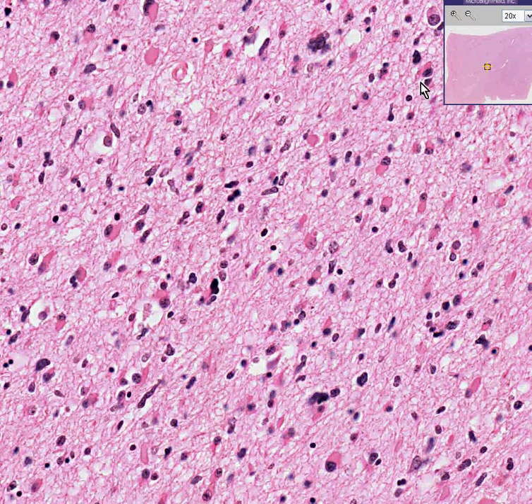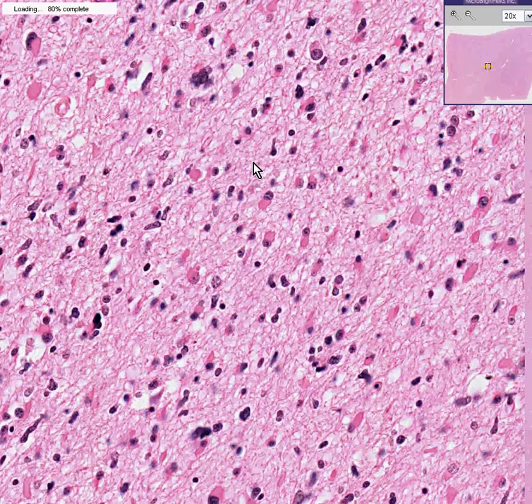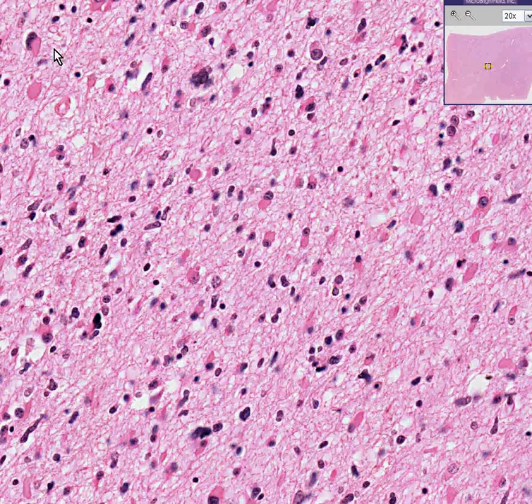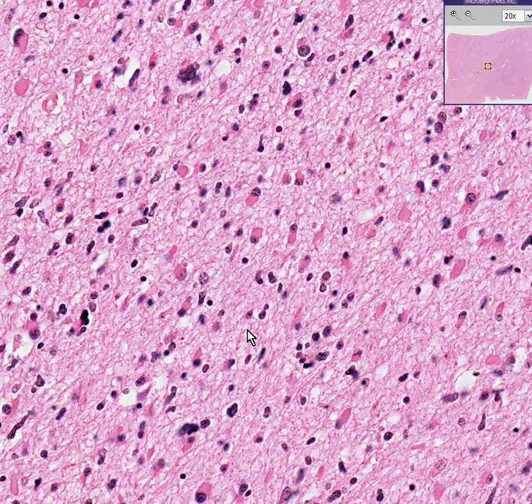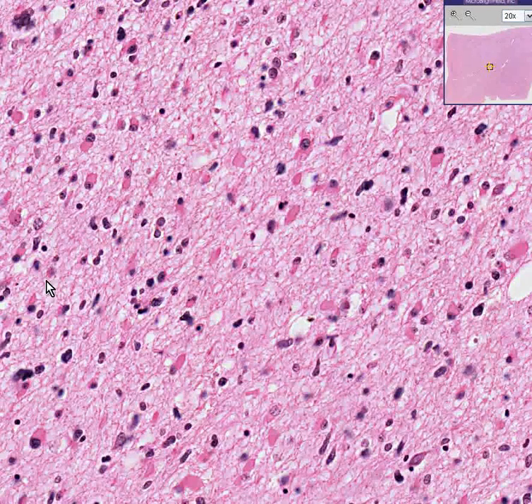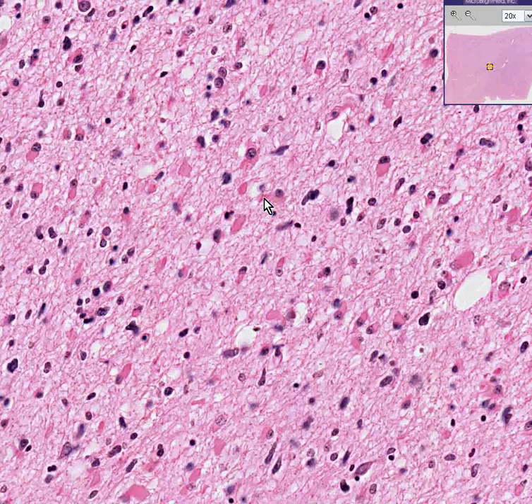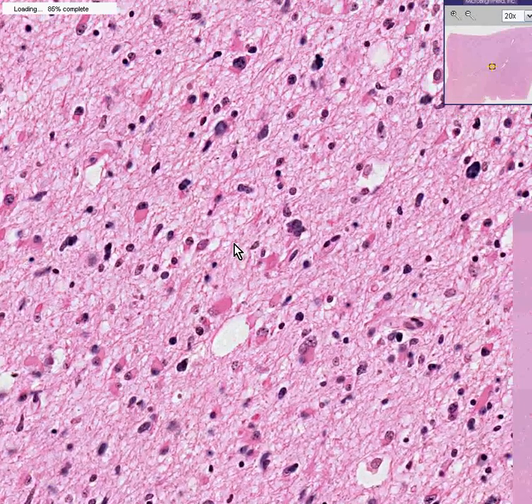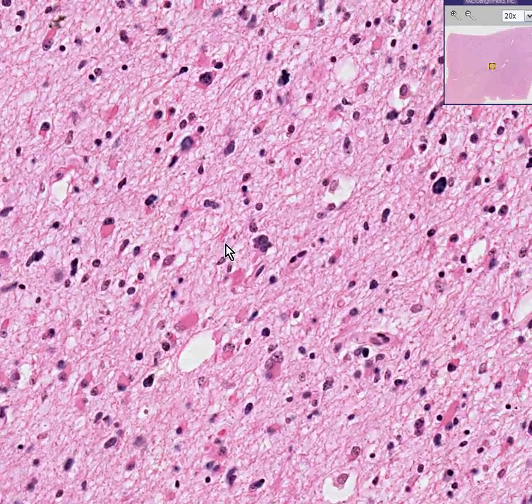Astrocytomas are generally called gliomas as well. Notice that they don't look terribly abnormal. Some may be a little bit bigger and darker than they should be, but for the most part, when you look at these cells — and 90% of these are glioma cells — notice that they look kind of benign.